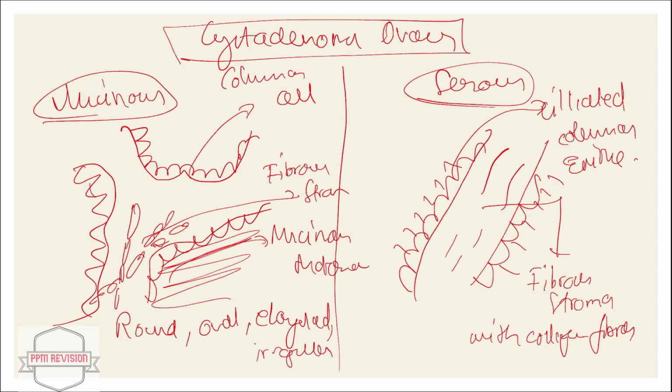Next, most of them are lined by a single layer of tall columnar epithelial cells, while rarely they undergo cystic dilation lined by flattened epithelium. So we can tell that columnar cells are most common. Next, most of the columnar cells are filled with mucoid secretion, faintly acidophilic, goblet cell type, with the nucleus at the cell base. So these columnar cells are mainly filled by mucoid secretion.